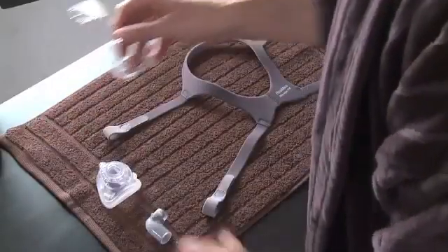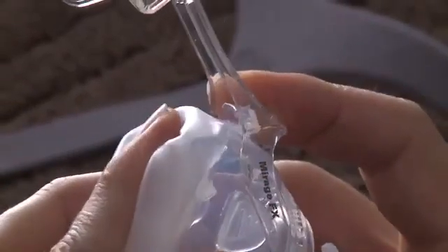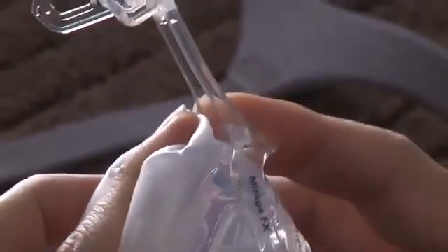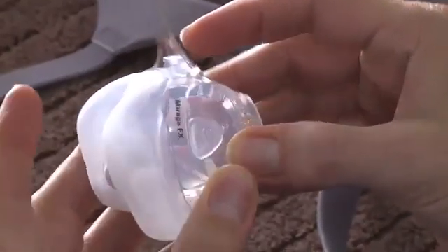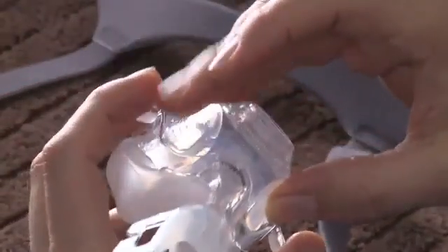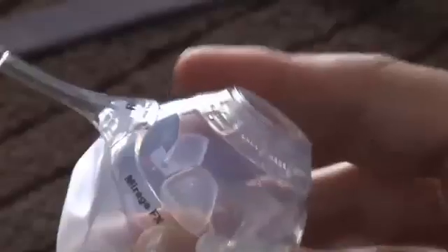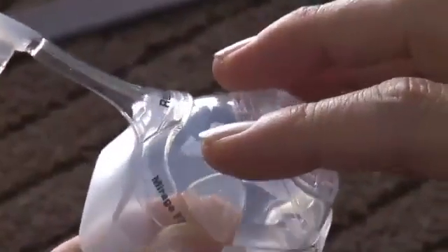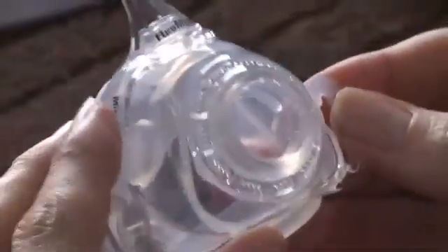Firstly, ensure the cushion is oriented correctly by aligning the top cushion tab with the recess in the top of the mask. Gently pull the cushion through the front of the mask frame until the cushion locks securely into place. The tabs on either side of the cushion should be sitting against the mask frame. Ensure the cushion is not twisted or distorted.